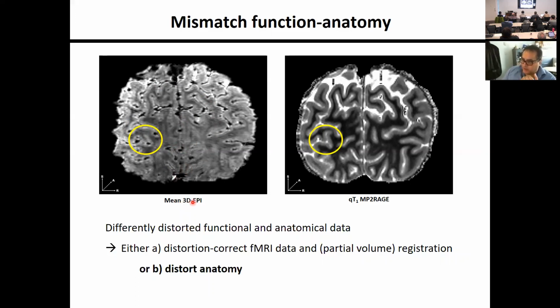So obviously we can make it better with using these images with distortion correction and partial volume registration. Anyway, I recommend that if you do registration, do not do registration of the entire image, but only the parts where you are interested in doing laminar fMRI analysis later on.